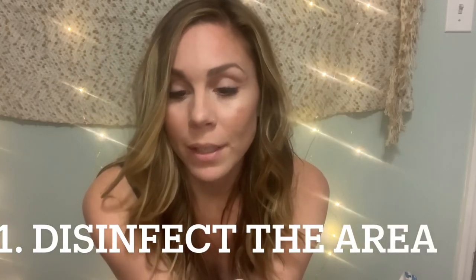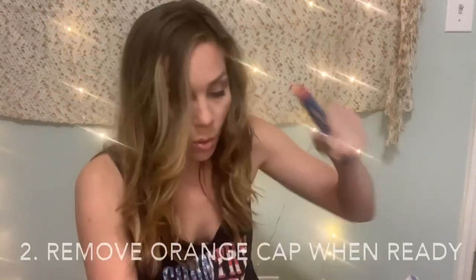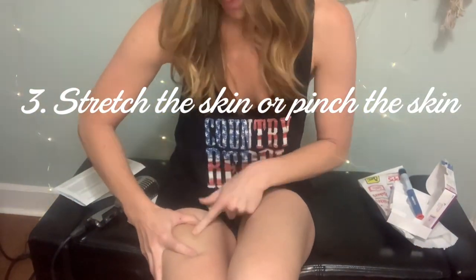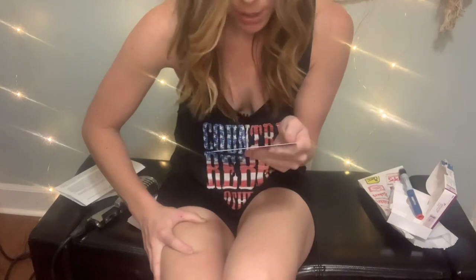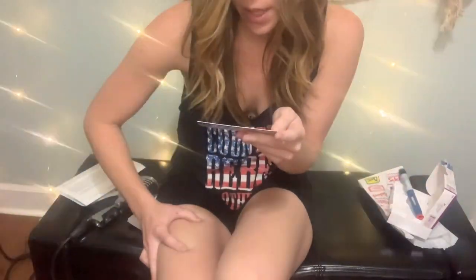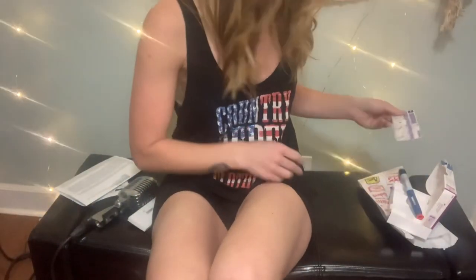Let's look at the instructions together. It says: prepare and clean your injection site — I'm going to be using my thigh today, that's where I prefer. Then it says to pull the orange cap off only when you are ready to inject. Do not leave the orange cap off for more than five minutes, as this can dry out the medicine. I'm going to stretch the skin out and inject the medication into my thigh. When the yellow safety guard hits my skin, we'll hear it click. After that, the window is going to turn yellow, letting us know that the medication has been administered.